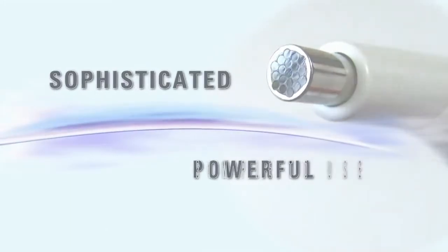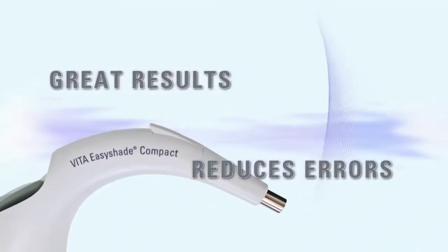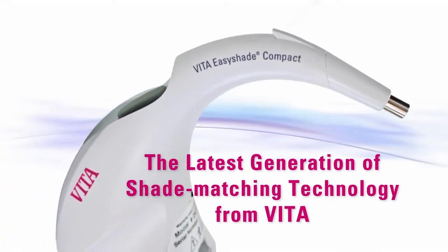Powerful, sophisticated, simple to use, time saving, reduces errors, gives great results. This is the latest generation of shade matching technology from Vita, the EasyShade Compact.